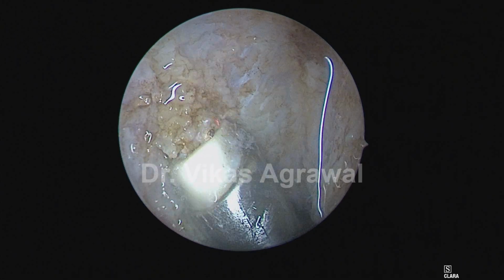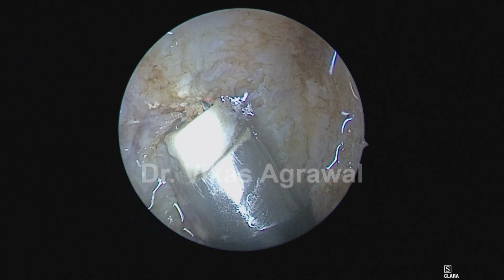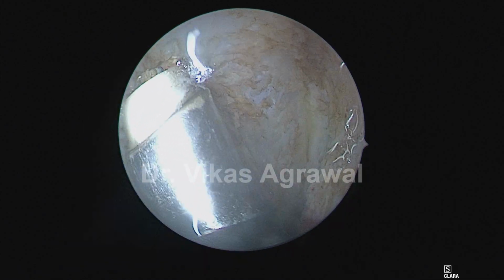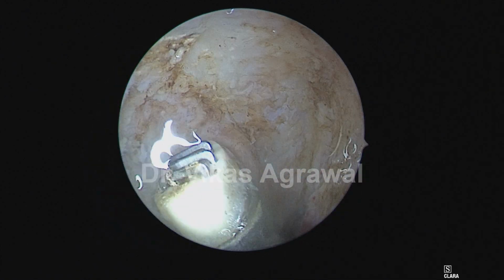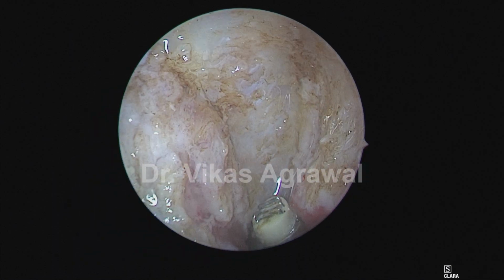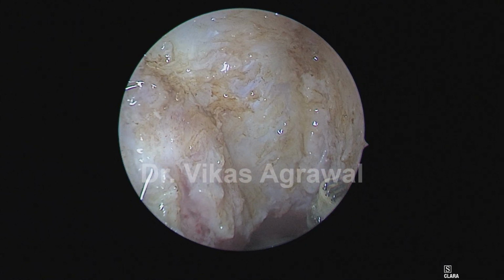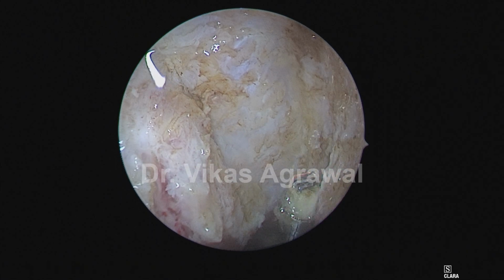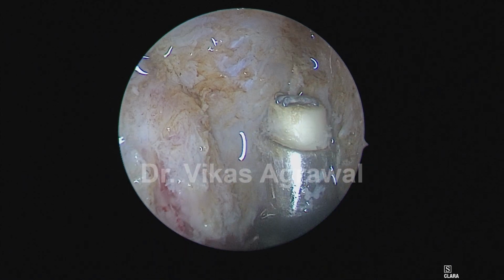And the last bit of tissues till the buccopharyngeal fascia. You can see it's completely cleared on the left side. All the boundaries are clearly seen. There's just a little bit of tissue here behind the torus, just a little bit more of lymphoid tissue, which I am removing.